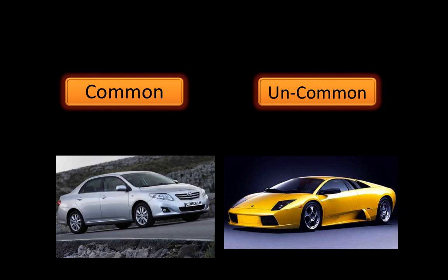Okay, I think I have described enough about the common chest X-rays. Then I will show you some cases in the next presentation, and after that I will describe the cardiac cases, especially the congenital cardiac cases and some of the normal pathologies which we usually find in chest X-rays.